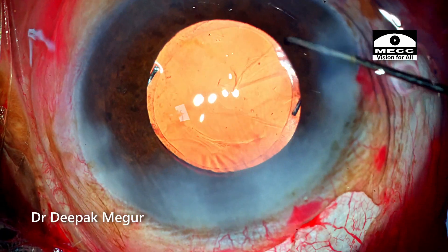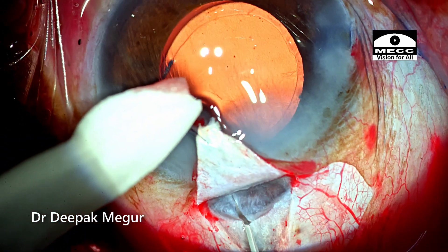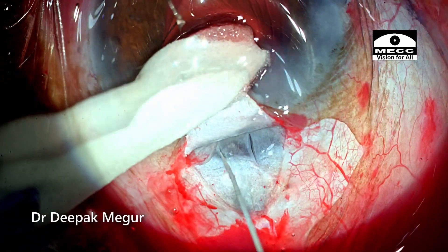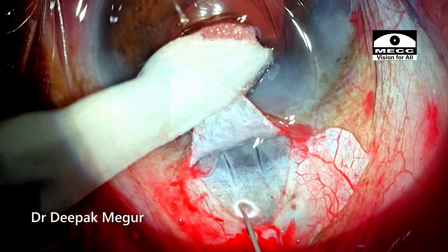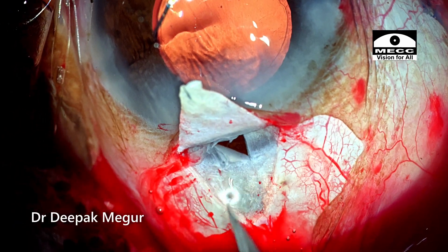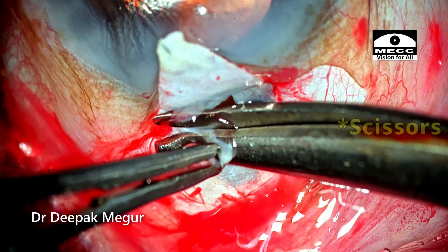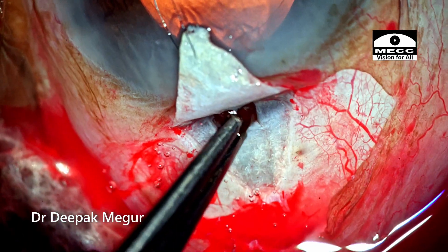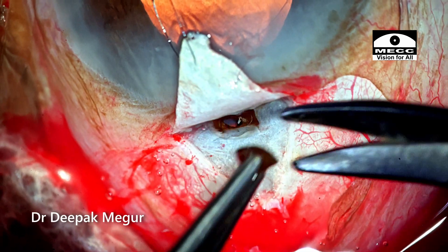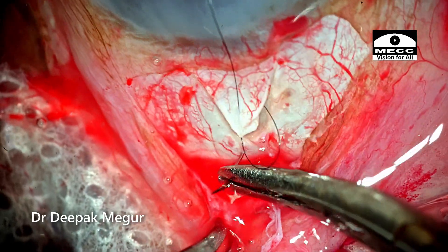Now is the time to perform the trabeculectomy. I go back and create the internal block, which measures approximately 2 mm by 1 mm. I'm using a side-port sharp blade to do the initial grooves, and then the corneoscleral tissue is excised with the help of forceps. Now is the time to perform the iridectomy. A broad basal iridectomy is done. Time to close the scleral flap.